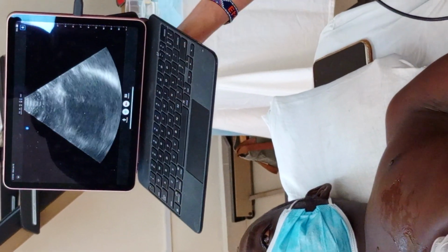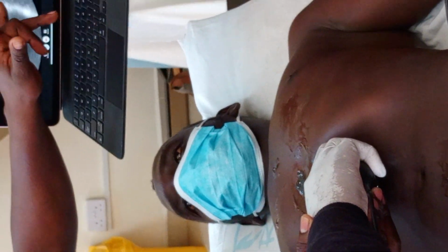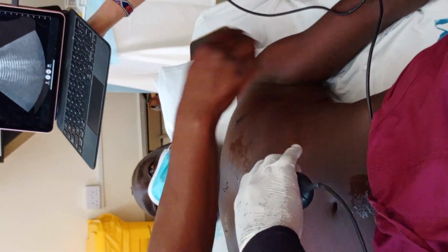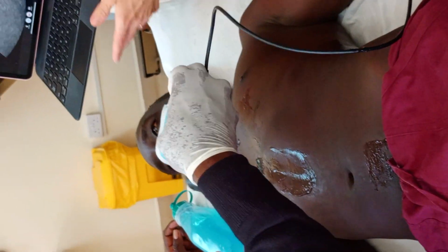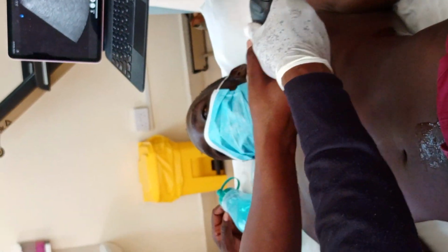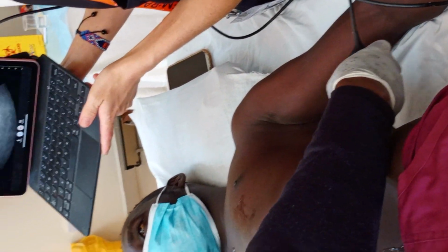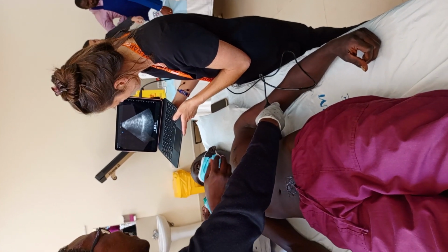Good view. How much are they? And then we can go to left. Get a little bit more gel. You're doing great. You're also in slippery gloves. Where do you want your indicator? Up first, the head. Way better. Yes, this is way better.